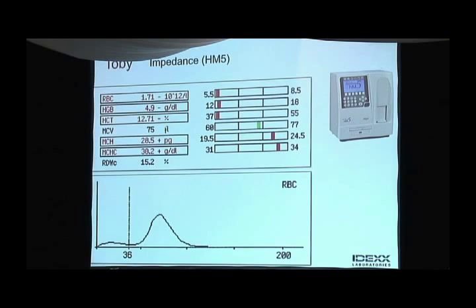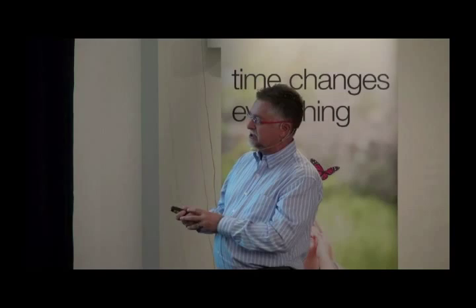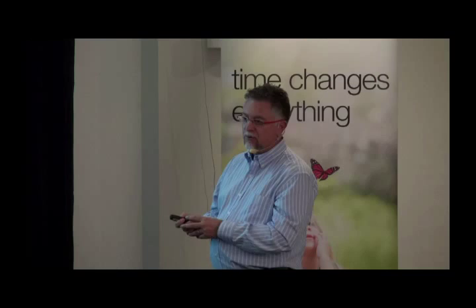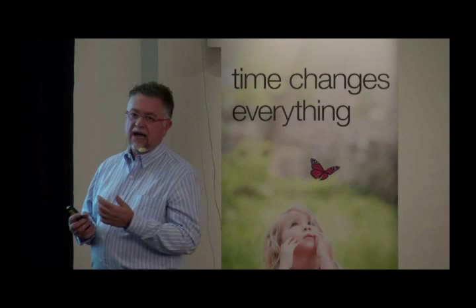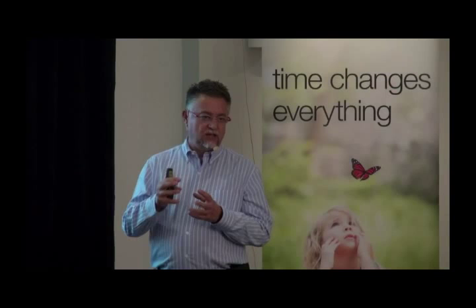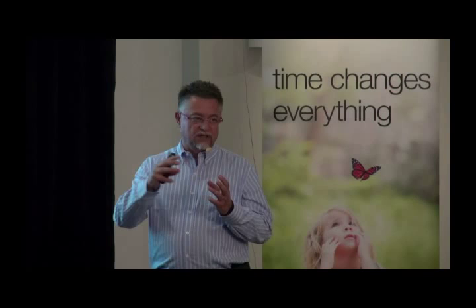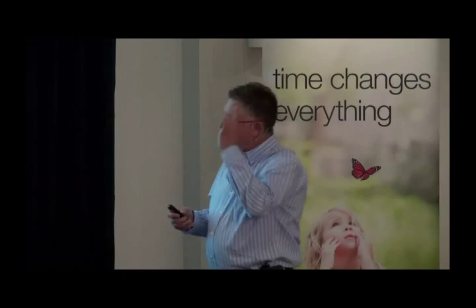Is his MCV normal? Yes, all right, so he has severe normocytic anemia so far, all right? And he has a high MCHC, all right? So he has normocytic hyperchromic anemia. So remember, the only way you can have hyperchromasia is if you have lipemia, all right? So this could be a postprandial sample and the fat interferes with a reading of the hemoglobin, or if you have free hemoglobin floating in between the red cells, okay? So when the instrument measures the total hemoglobin, it's measuring the hemoglobin that is within the red cells and the one that is in that pink plasma bathing the red cells. In other words, hemolysis, all right? However, the anemia is normocytic.